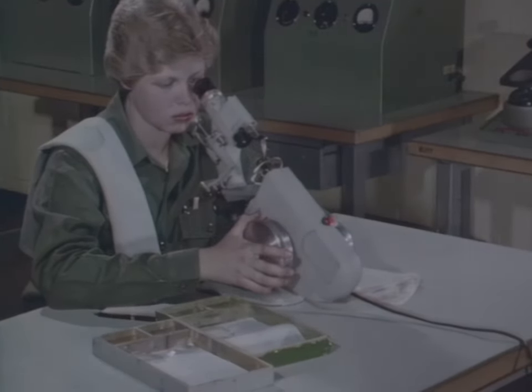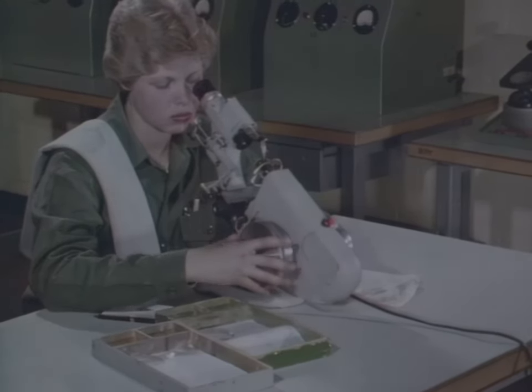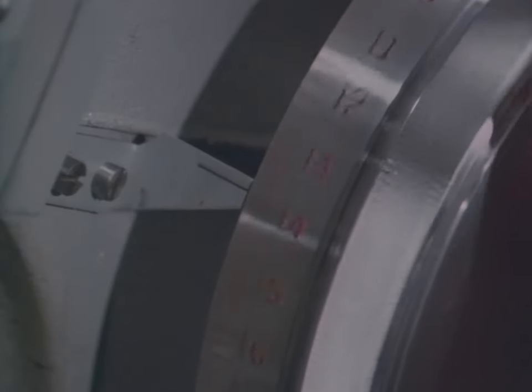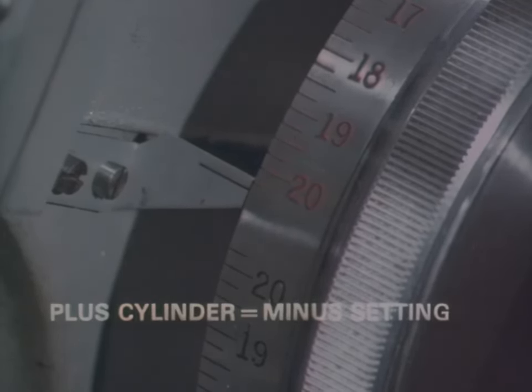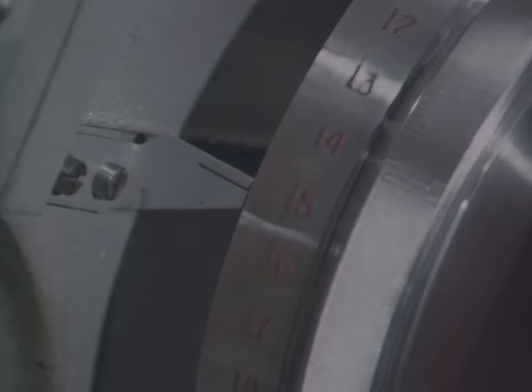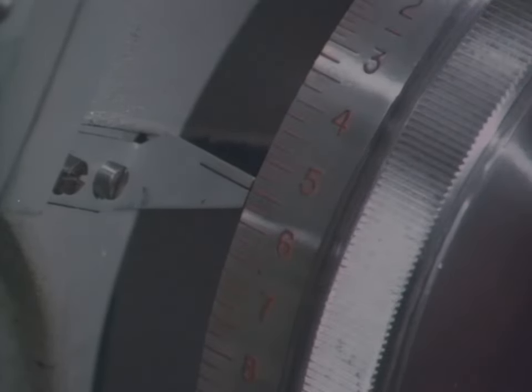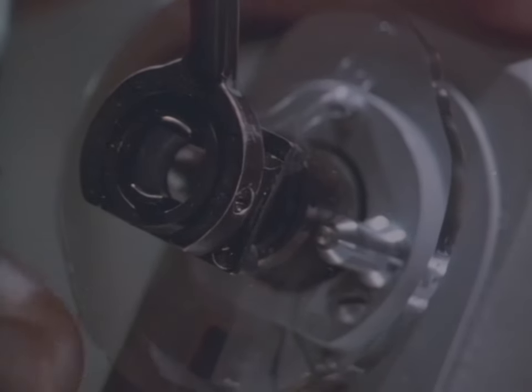You must learn the correct step-by-step procedure for neutralizing cylindrical lenses. First, we'll show the procedure for neutralizing a single vision glass lens working in plus cylinder form. Turn the power wheel to the full minus setting. Think opposites: plus cylinder, use a minus setting. Now turn the power wheel until one set of lines comes into focus — this should be the thin lines. If it's not the thin lines that come into focus first, turn the lens 90 degrees until you get a sharp focus on the thin lines.